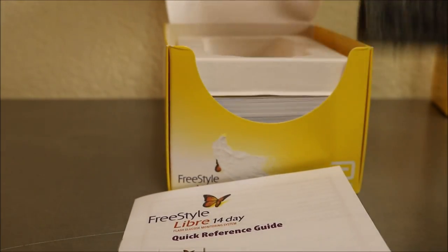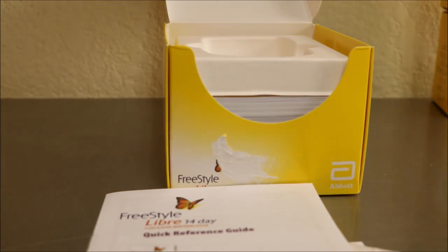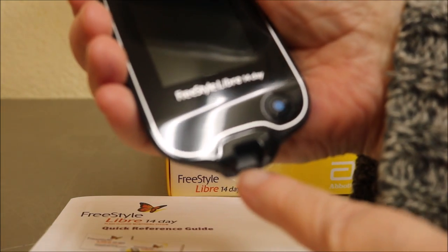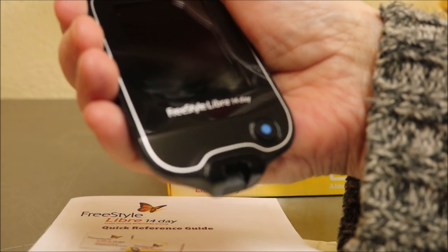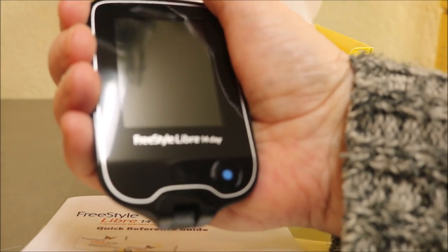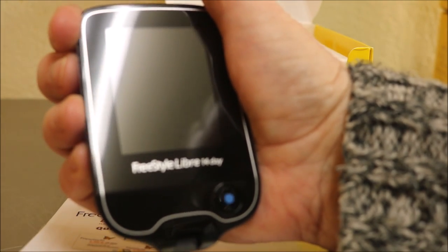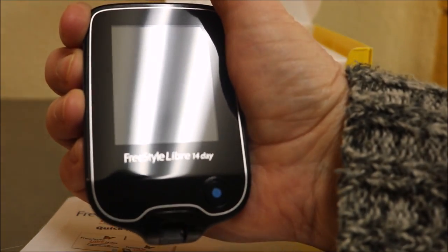Here's the device — it's bigger than a glucometer but smaller than a cell phone. What I think is nifty is that it is also a glucometer, so if you're inclined to stick your finger, you can stick a test strip in there and get a reading. This will record internally for up to 30 days, and you can also add notes to it.